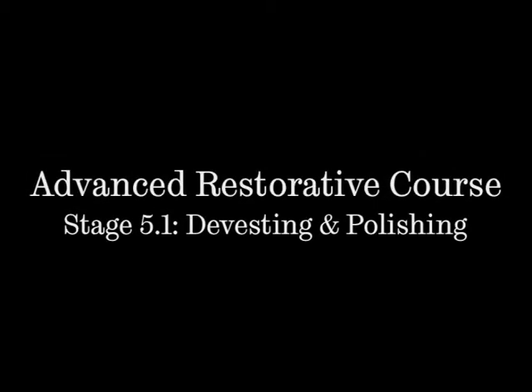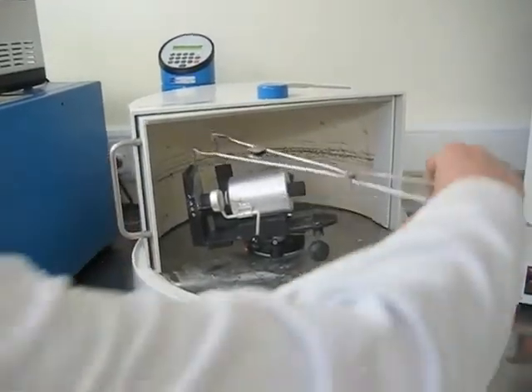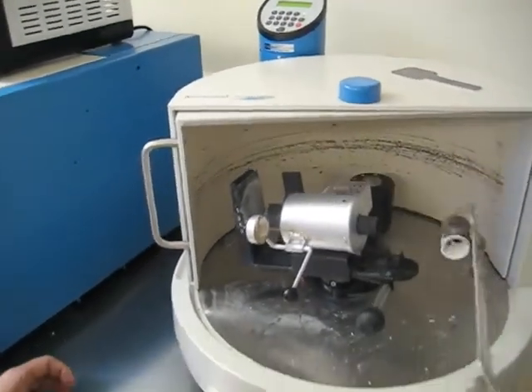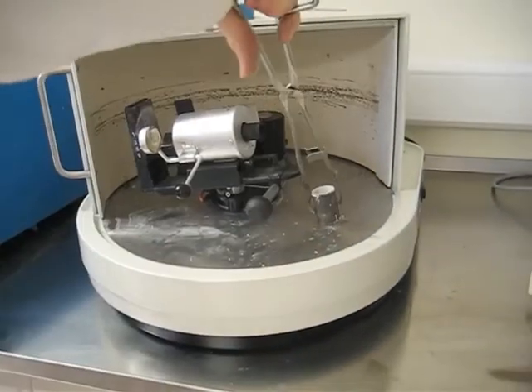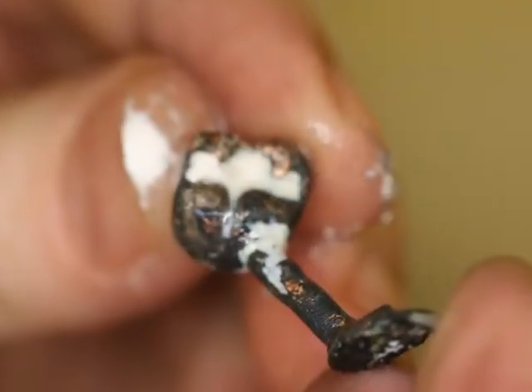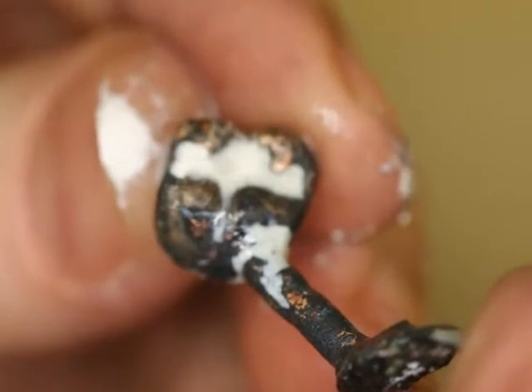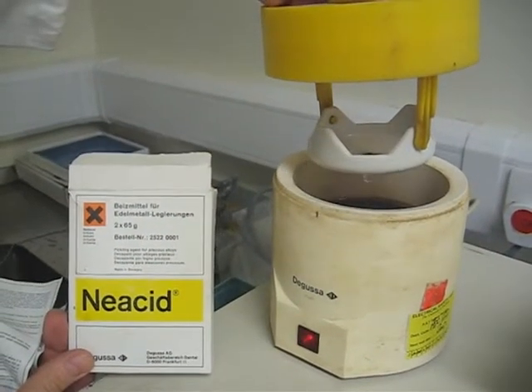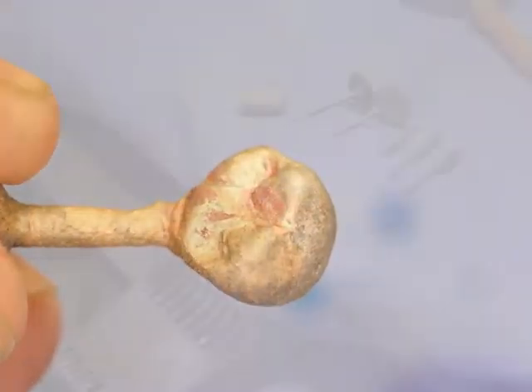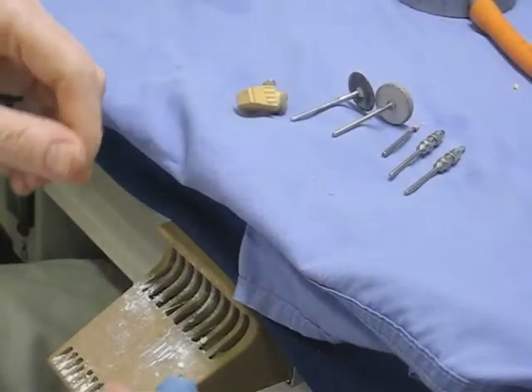Stage 5.1: divesting and polishing. Once the spin cycle has finished in the furnace, we open the door and out comes the casting. It's still quite warm at this stage — probably about 500 degrees — so you don't want to be touching it yet. After it's cooled down we knock it out of the casting ring. We then put it in some acid to take off all the oxide on the surface; that process is called pickling.